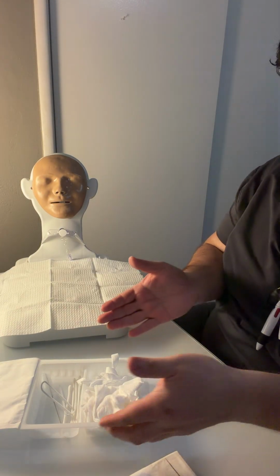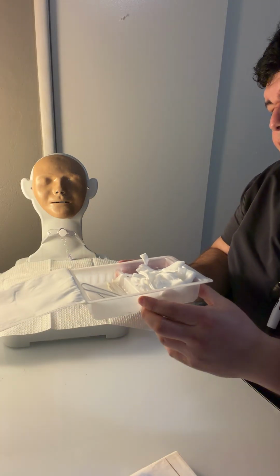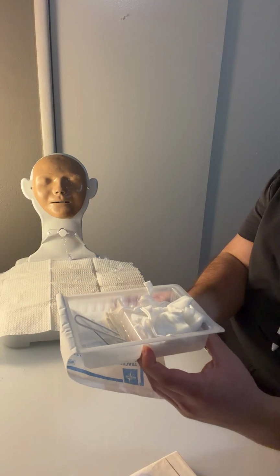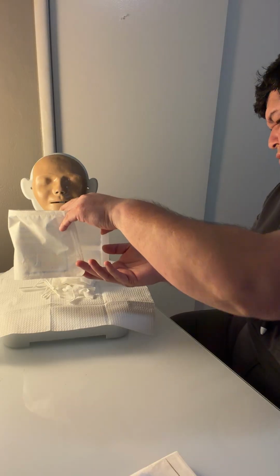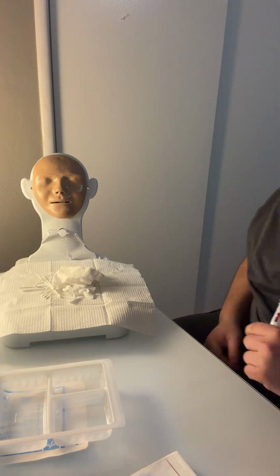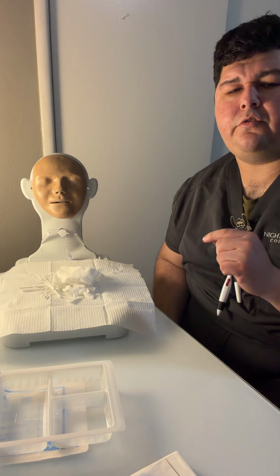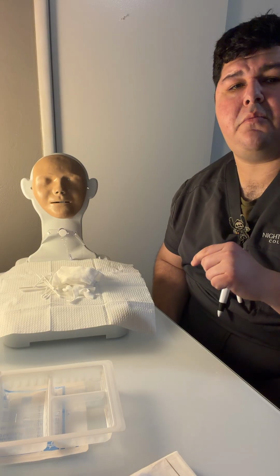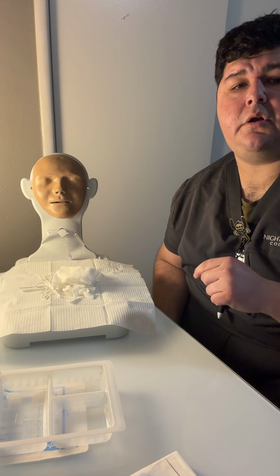Okay, we're going to take our tray and empty it into the field. Take our tray. We're going to pour our soaking solution of sterile normal saline into the container, and then one of them is going to be the peroxide cleaning solution. At this point, we're going to don our sterile gloves.